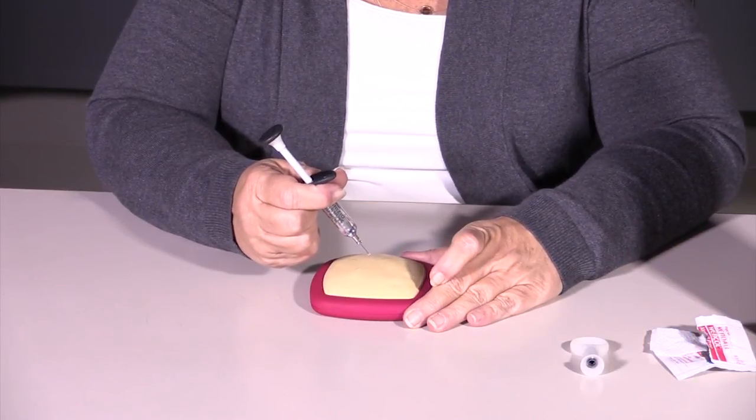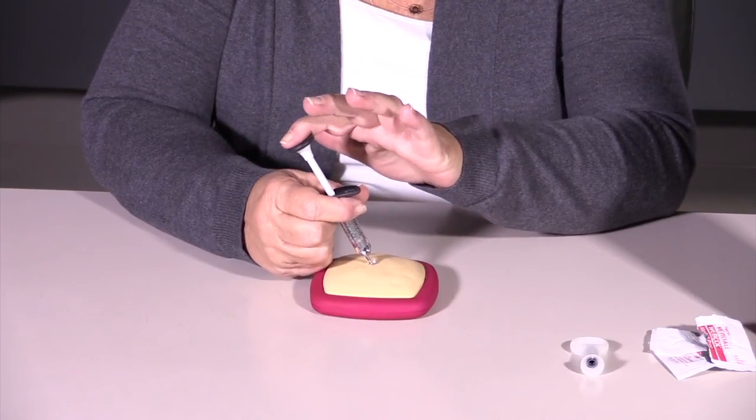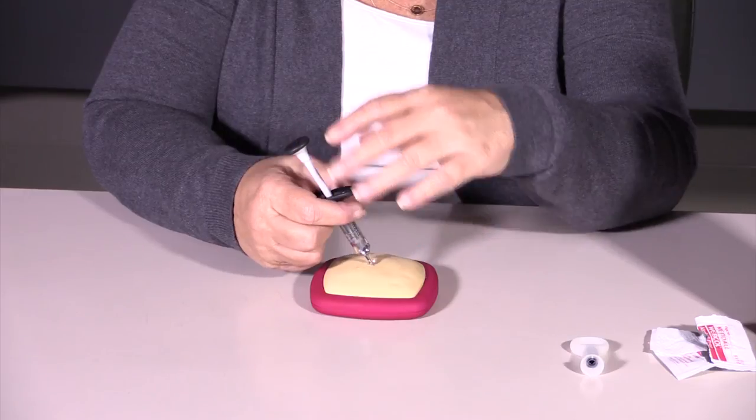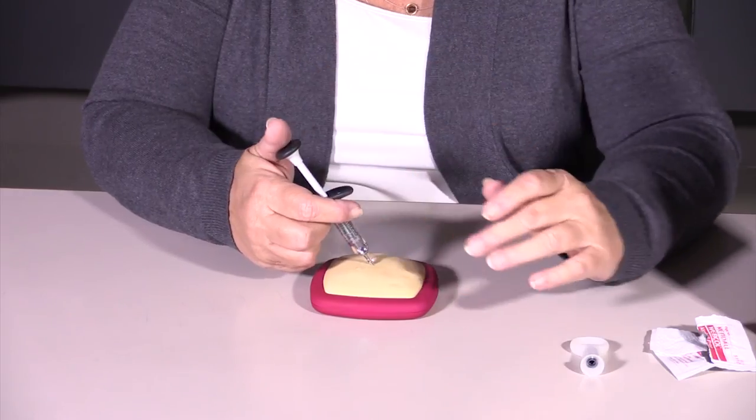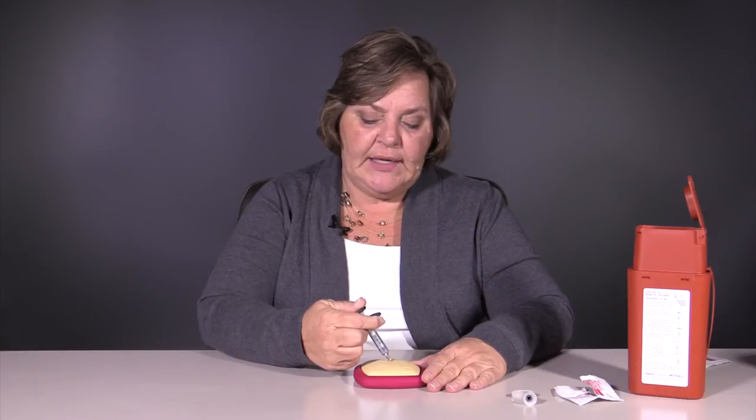Then you're going to enter the skin firmly but quickly at a 45-degree angle. Once you've entered the skin, you can depress the plunger either with the same hand using your thumb, or your other hand — whichever is most comfortable. This medication is thick, but most people say that it doesn't hurt at all. It's fairly thick so it doesn't enter quickly, but just apply steady pressure to get the medication to enter the body.